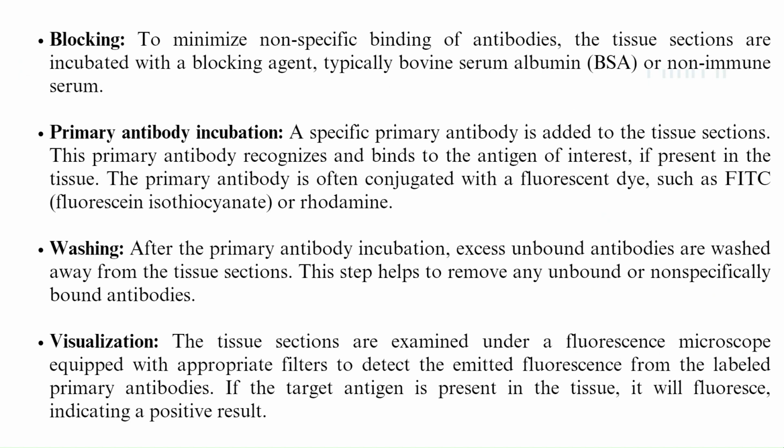Visualization. The tissue sections are examined under a fluorescence microscope equipped with appropriate filters to detect the emitted fluorescence from the labeled primary antibodies. If the target antigen is present in the tissue, it will fluoresce, indicating a positive result.